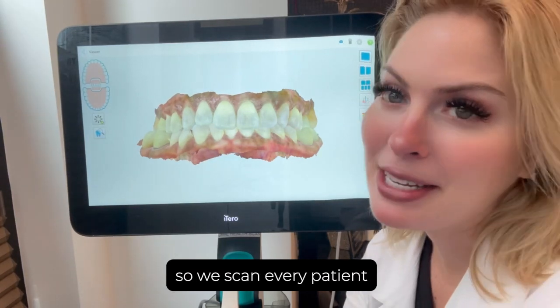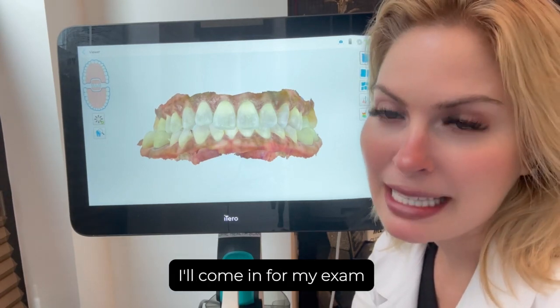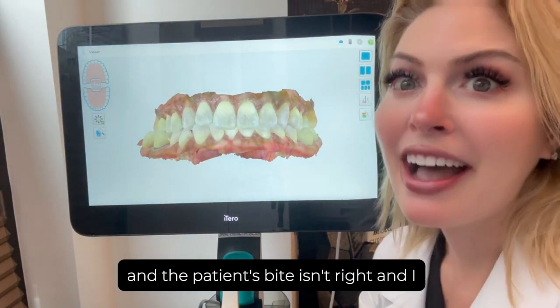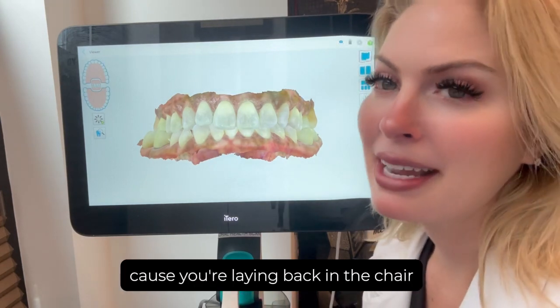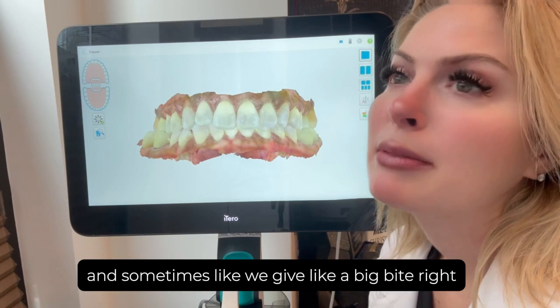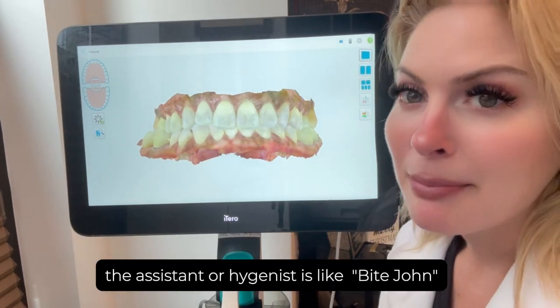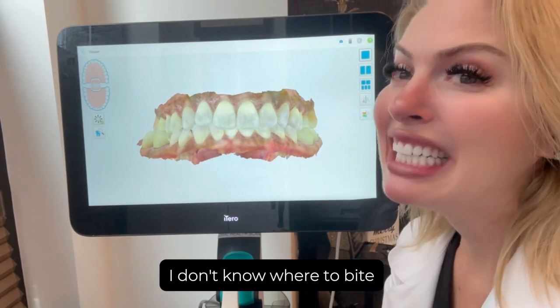We scan every patient every time they get their teeth cleaned, and sometimes I'll come in for my exam and the patient's bite isn't right. This happens all the time because when you're laying back in the chair you can't bite your teeth together properly, and sometimes we get a big bite — the assistant or hygienist says 'bite down' and you're like 'I don't know where to bite.'